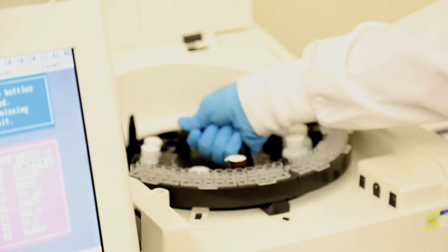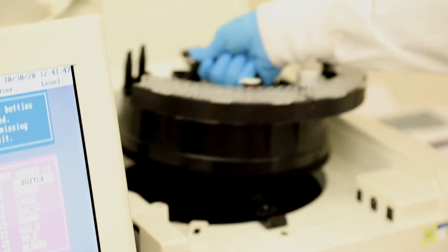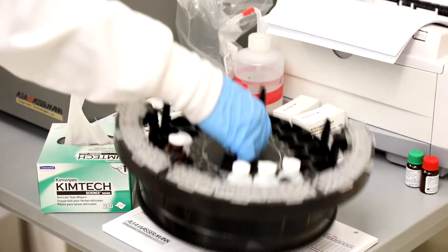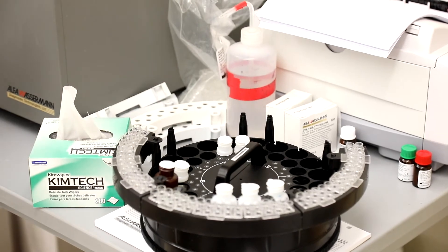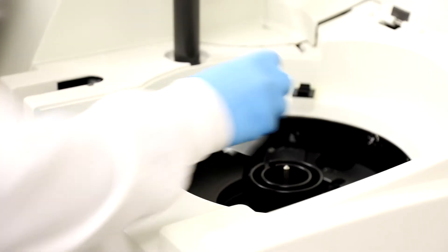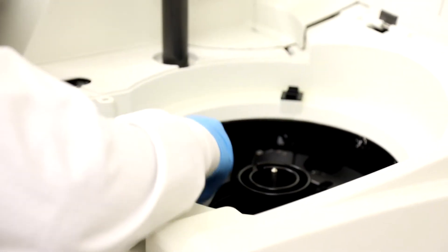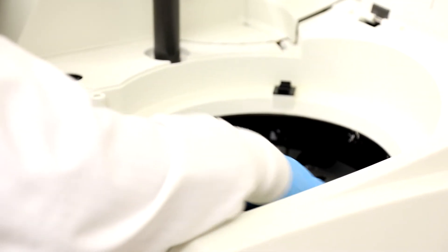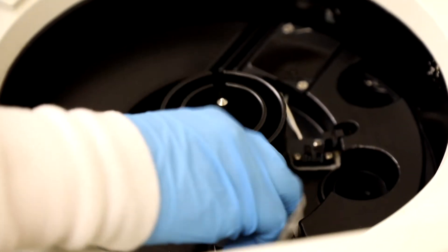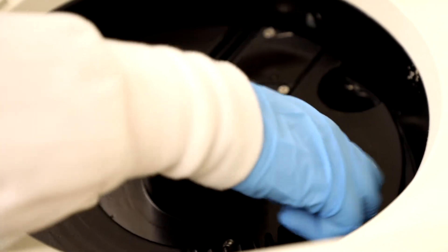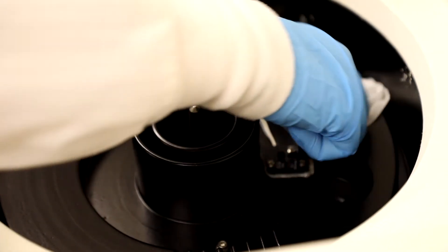Next, pull out the reagent carousel by gripping the handle and pulling up. You will then wipe the interior with a Kimwipe, making sure to rid the compartment of condensation buildup on the lenses.